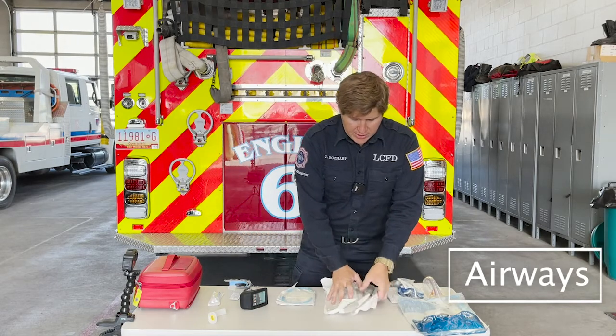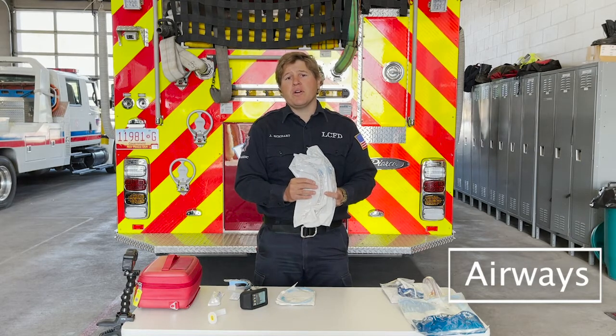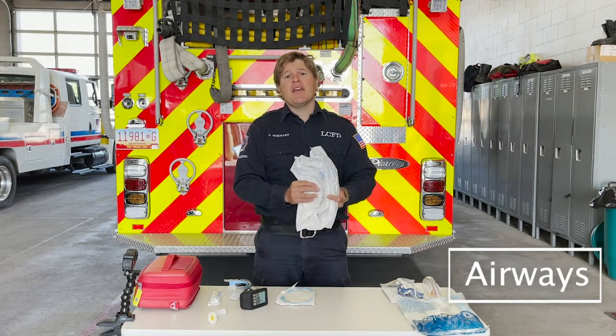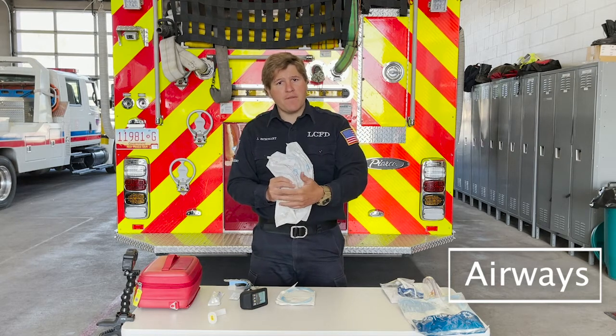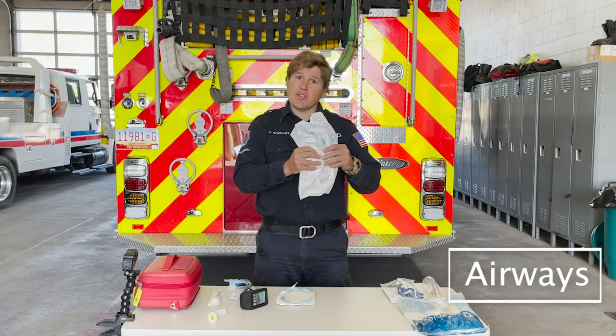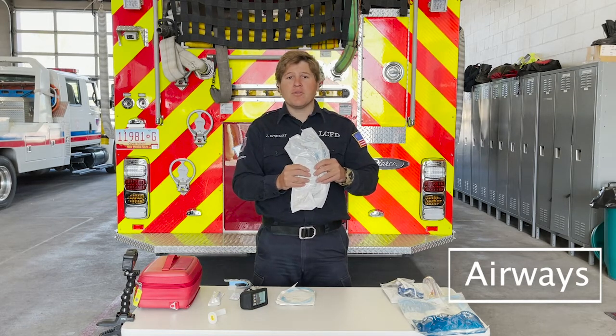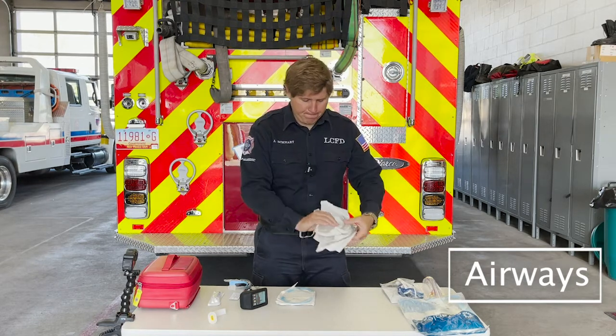Having multiple size ET tubes ready to go, one above and one below that you think you're going to need for intubation, having that ready to go next to you will help, not only if your first cuff fails, but if you're not able to pass that tube and you need a smaller one, or perhaps you need a larger one, it's ready to go next to you and you don't have to run through a bag.